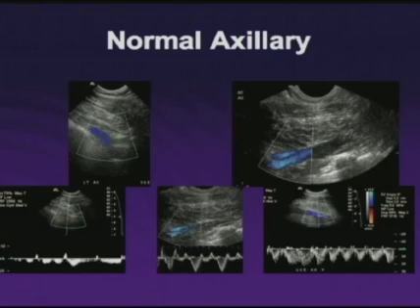Axillary veins may demonstrate some reversal or may just be phasic, looking more like a leg vein, but in most cases you can identify a bit of flow reversal in the axillary vein. I remind you that the peripheral subclavian and axillary veins can also be compressed.